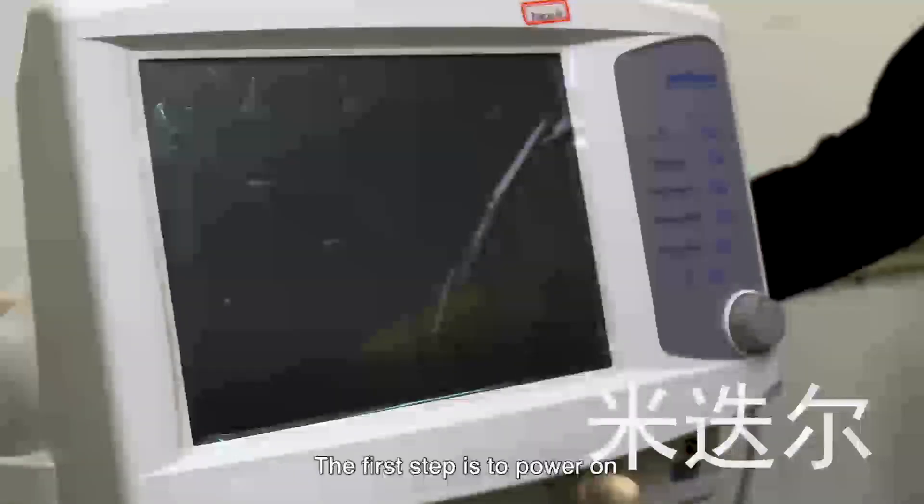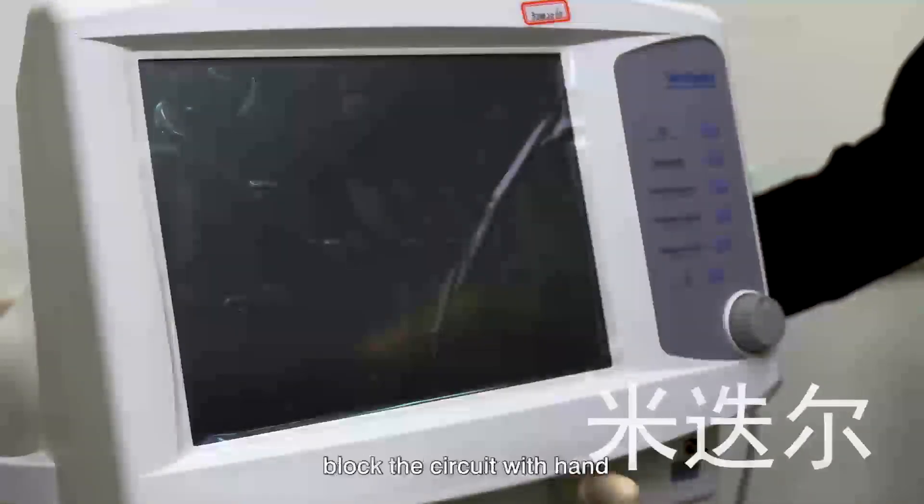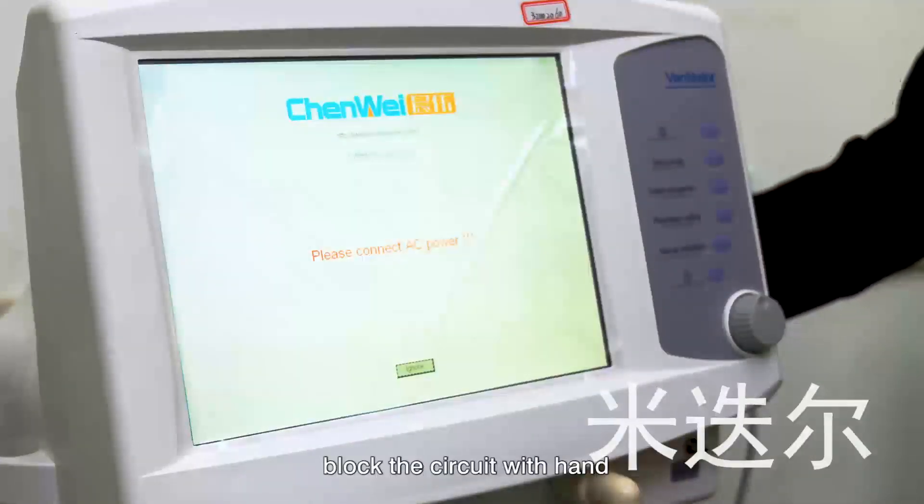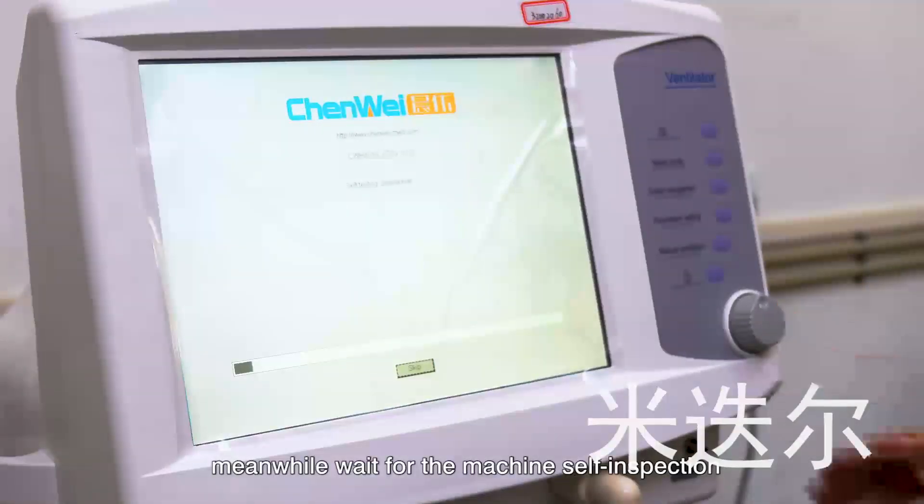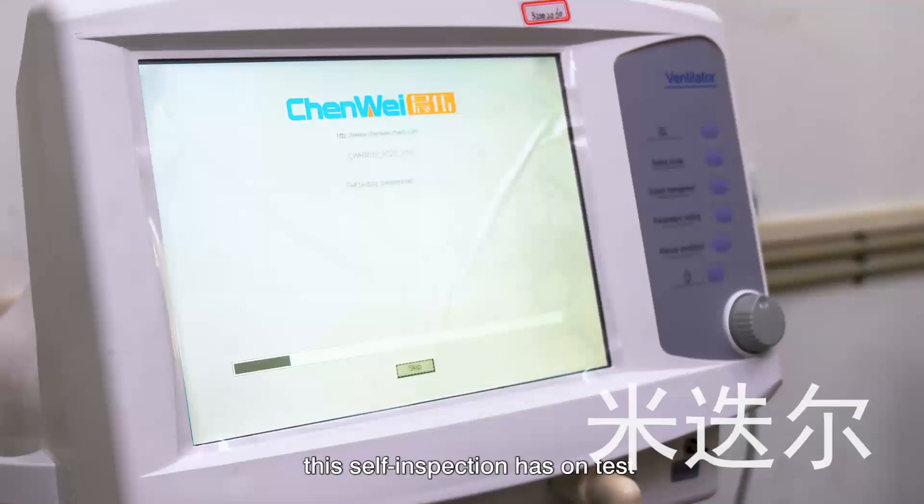The first step is to power on. Block the circuit with hand. Meanwhile, wait for the machine's self-inspection. This self-inspection has one test, the sensor detection.